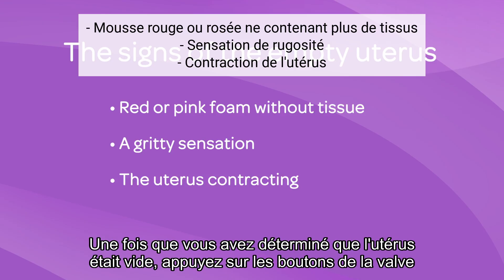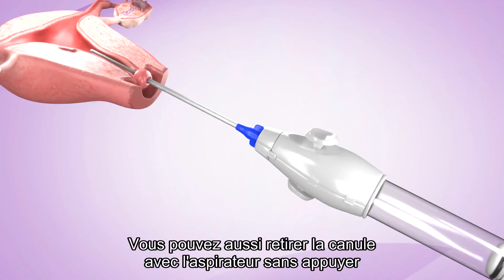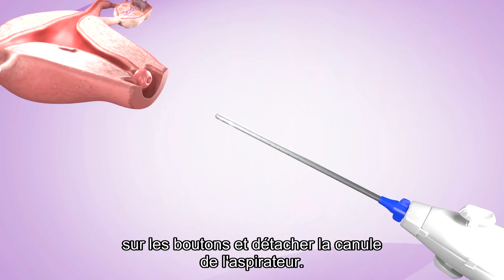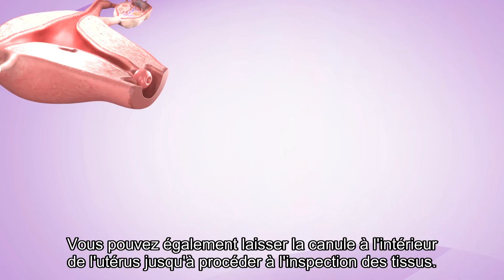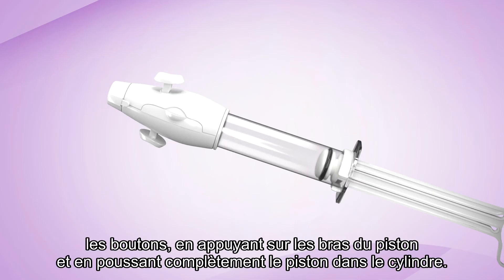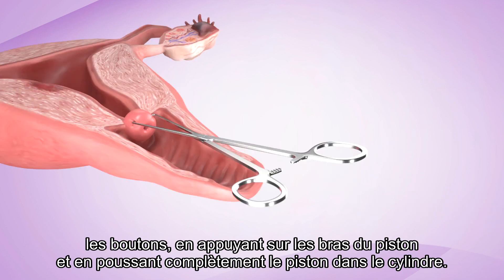When you have established that the uterus is empty, depress the valve buttons and remove the cannula from the uterus. Alternatively, withdraw the cannula and aspirator together without pressing the buttons and disconnect the cannula from the aspirator. You could also leave the cannula inside the uterus until you do the tissue inspection. Empty the contents of the aspirator into an appropriate container by releasing the buttons, squeezing the plunger arms, and pushing the plunger fully in the cylinder.